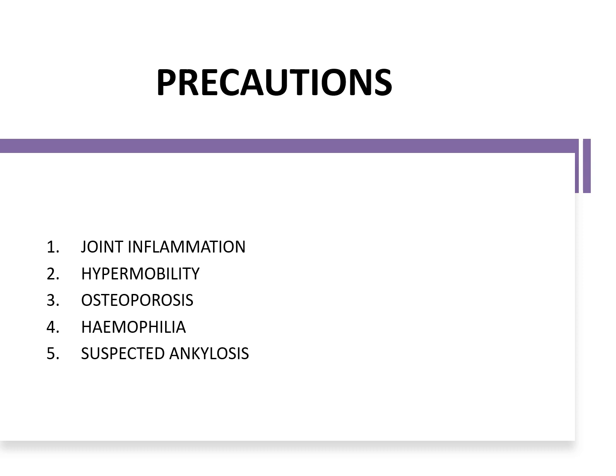Then suspected ankylosis, where there is fusion and stiffness of the joints. In such cases, the therapist should be cautious. You are supposed to do goniometry definitely in all of these patients, but you need to maintain the precautions while doing your technique on goniometry.